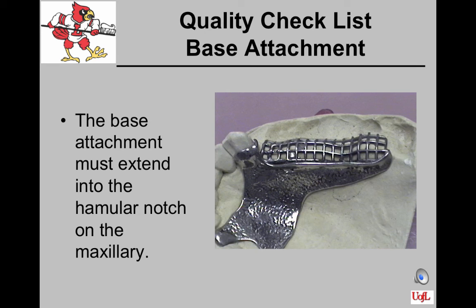The external finish line on the maxillary RPD should extend just lingual to the hamular notch area. The acrylic resin should extend into the hamular notch area to provide maximum support for the prosthesis. An exception to this would be if a metal base partial is created, where the metal would extend all the way into the hamular notch area.